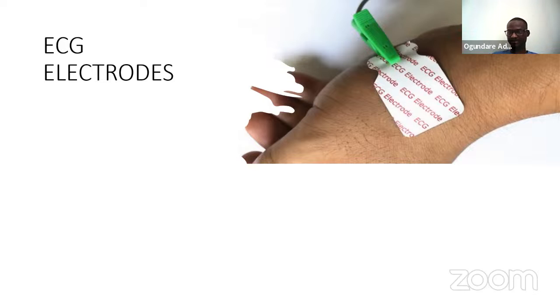There are different types of electrodes. Some are vacuum that you press like this. Some are like an alligator clip, like a handcuff. But they all do the same thing. And there are some that are just like stickers.